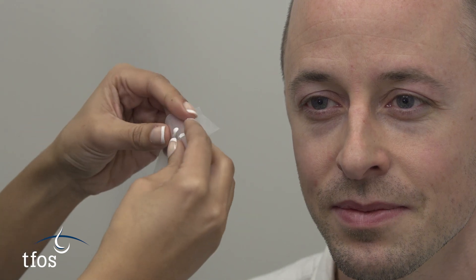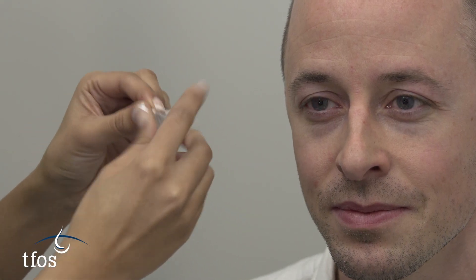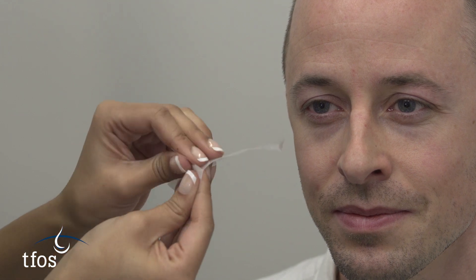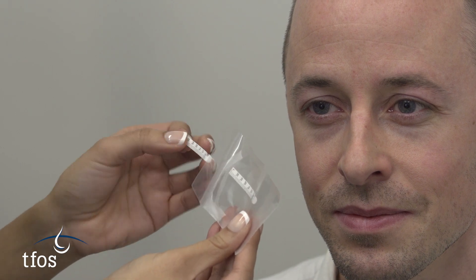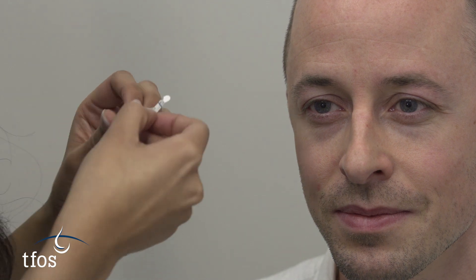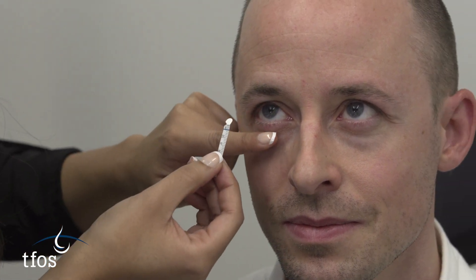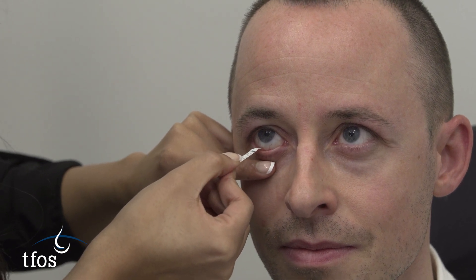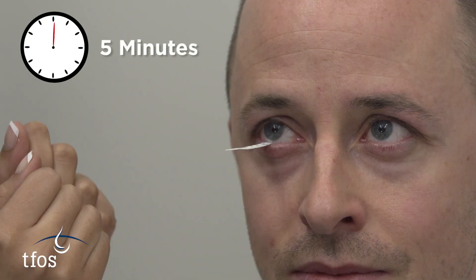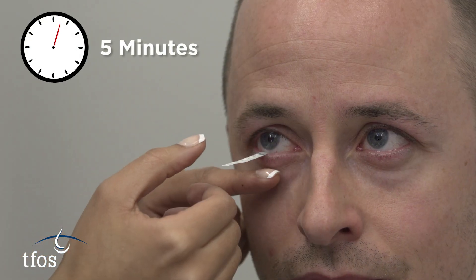More invasive ways to evaluate tear volume include the phenyl red thread test and the Schirmer test. The main role of the Schirmer test is as a provocative test of reflex tearing to determine lacrimal gland function, and therefore should be performed without topical anaesthesia. Bending the strip at the notch, ideally without touching the filter paper to avoid contaminating it with skin oils, the hooked end is placed over the lower lid margin, ideally within the temporal third. The strip is left in place for five minutes and the wetted length measured from the notch after this time.